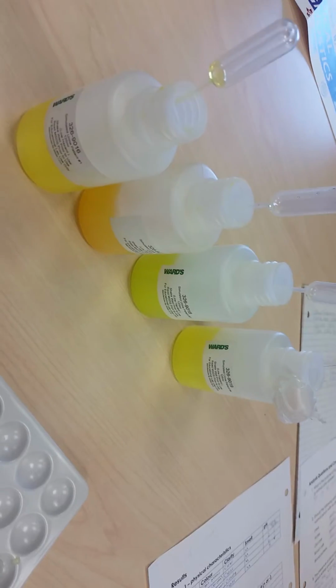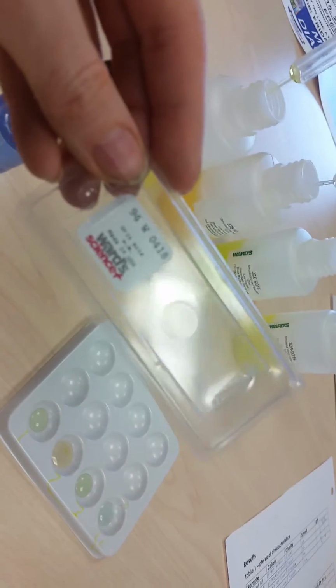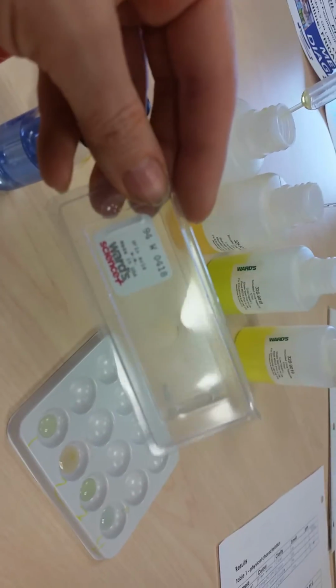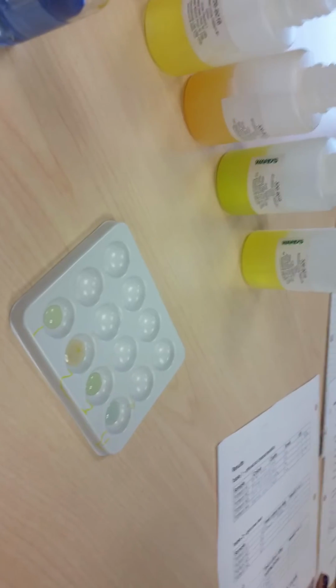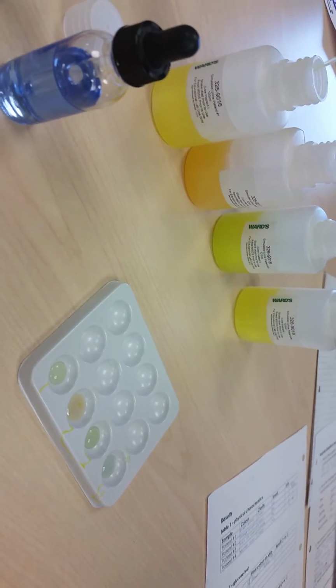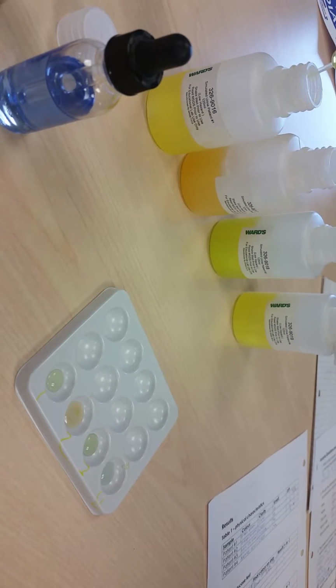If you're interested in seeing what those crystals can look like, you can always ask to borrow this from me. It's a slide of uric acid, and you can actually see what that would look like underneath the microscope. In your lab, your table that indicates whether cells were found are already marked for you.